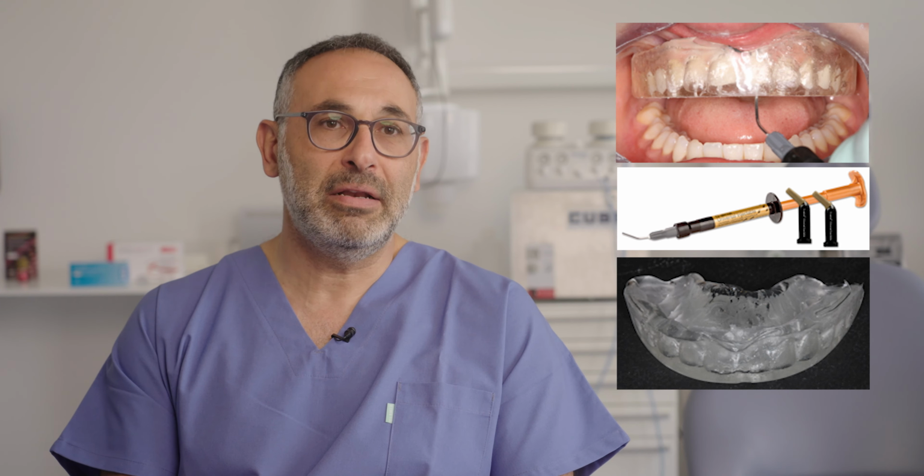What product to use to do a mock-up? It depends on your support. If you are using a transparent vacuum tray, then you can use any flowable composite. It is preferable that it's a highly filled composite, like for instance Genial Universal Injectable, or any other material filled above 65% by weight of fillers, so the light cure can penetrate through the vacuum tray.